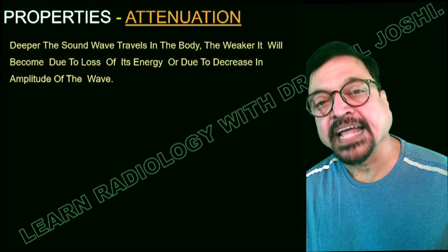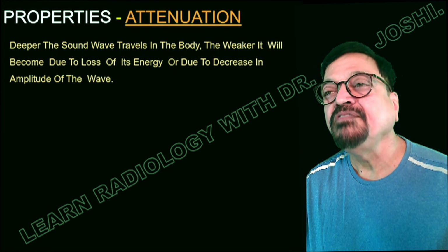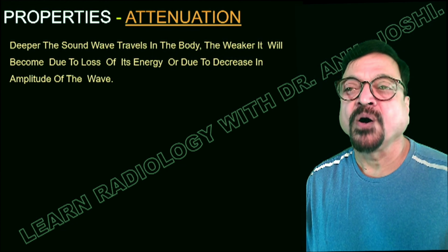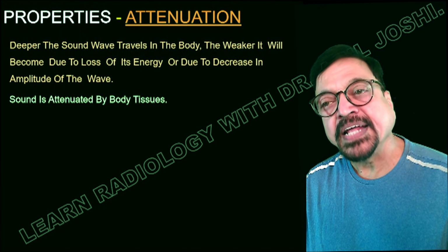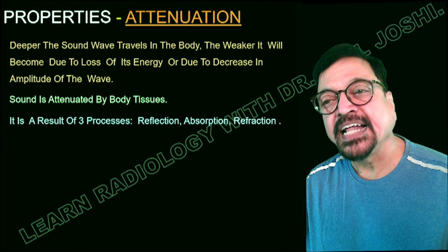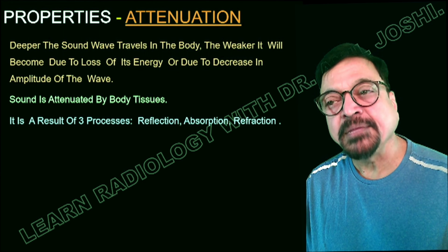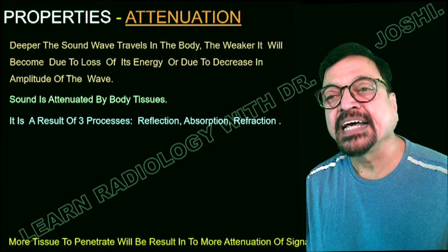Next is attenuation. The deeper the sound wave travels in the body, the weaker it will become due to loss of energy or due to decrease in amplitude of the wave. Sound is attenuated by body tissues. Attenuation is a result of three processes: reflection, absorption and refraction.